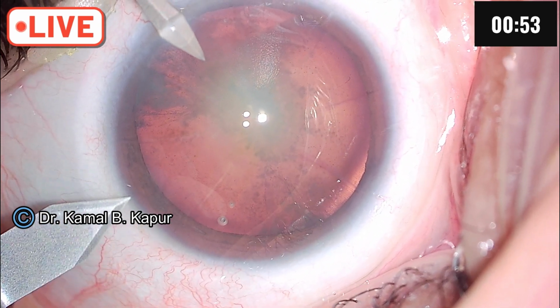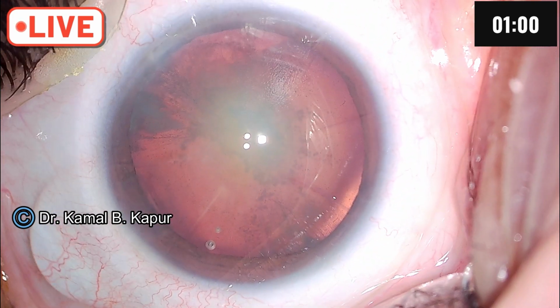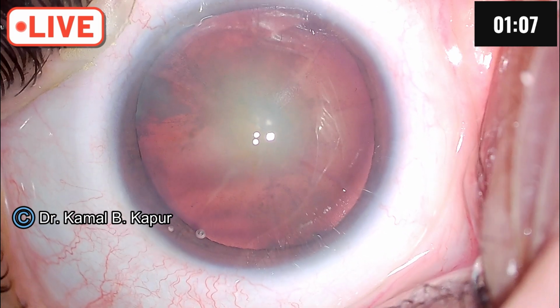I will find the area in between and have a slightly longer tunnel, and then you will notice we have nearly 0.75 millimeter of tissue space on either side. Viscoelastic.